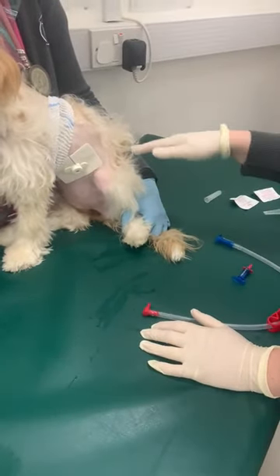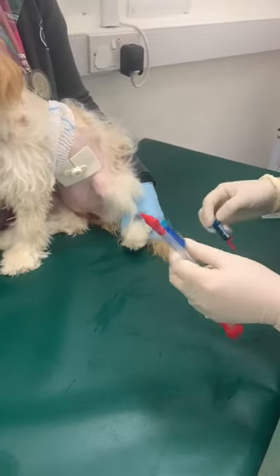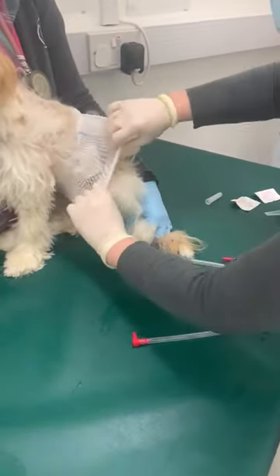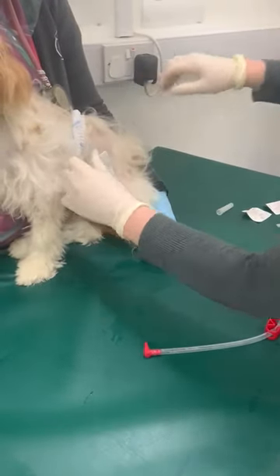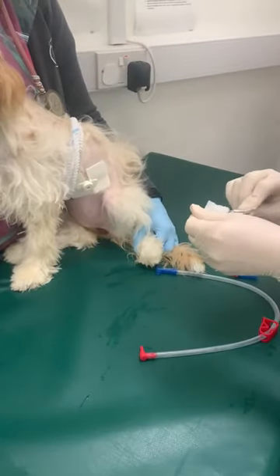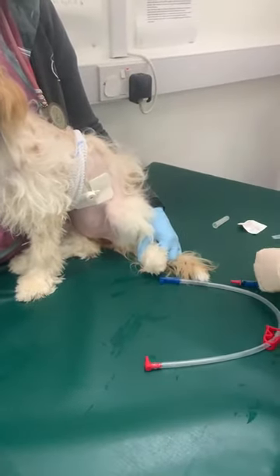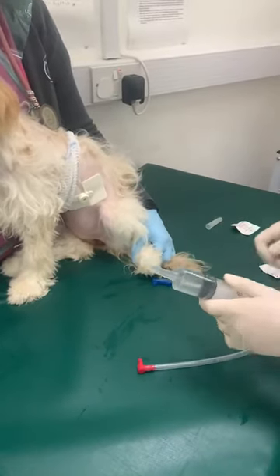When feeding via the feeding tube, you will be provided with two attachments. I'll show you how to use both of them. You'll find the patient will have the dressing over like this, so you want to just pull it back. You'll be provided with some little wipes just to wipe the area before you attach, so you can just clean this area like this.